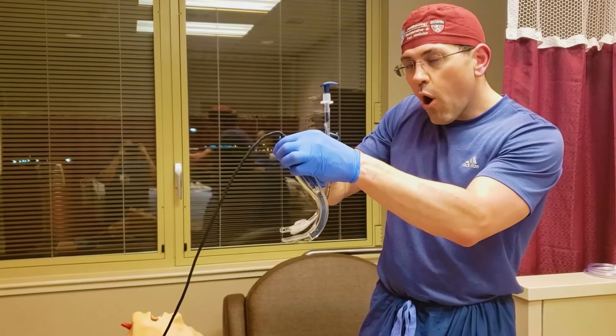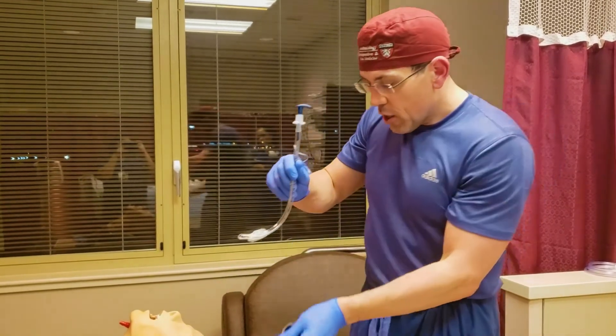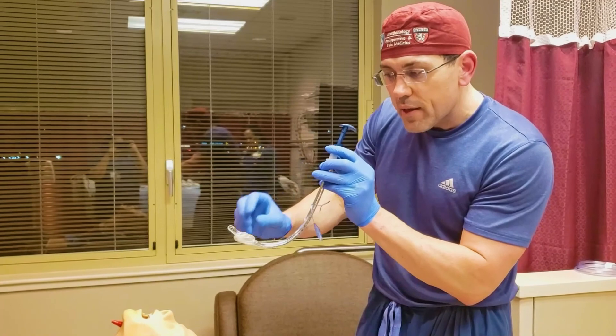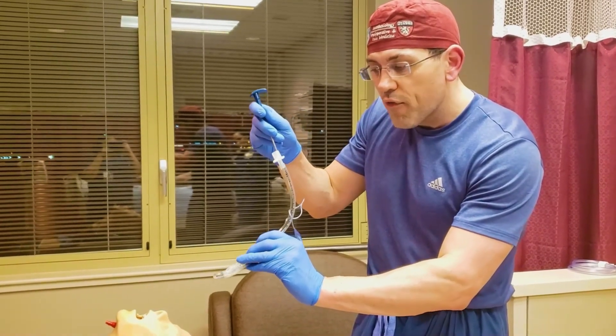This point is so important it warrants emphasis: the stylet of the GlideScope is so curved that very often when we come in, we hit the anterior portion of the trachea, making it difficult to slide the endotracheal tube off the stylet. When you hit that anterior portion and can no longer advance, pull the stylet back just a little bit. This makes the tip flexible and bendable, allowing you to advance the ET tube off the stylet smoothly.